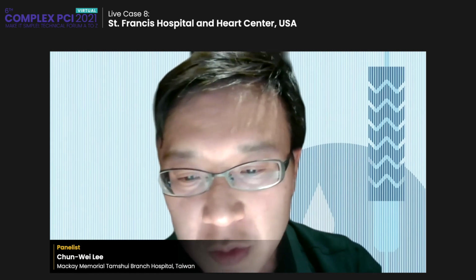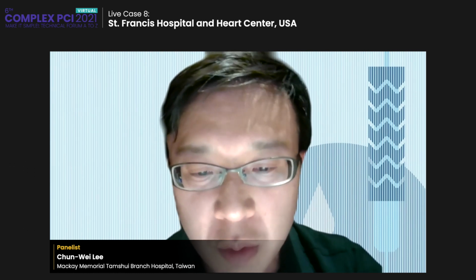Great. Dr. Lee, do you have any experience with that? Well, in Taiwan, we don't really have Shockwave currently, so we don't have experience with it. For most calcified lesions, we still start with a balloon, NC balloon, cutting balloon, Scoreflex, or a rotablator.